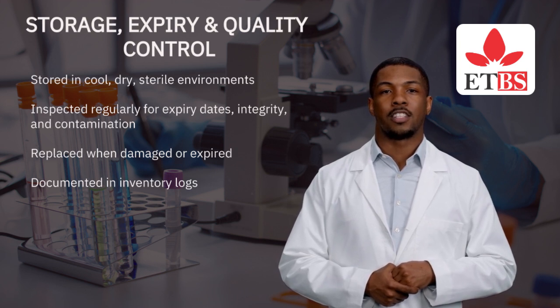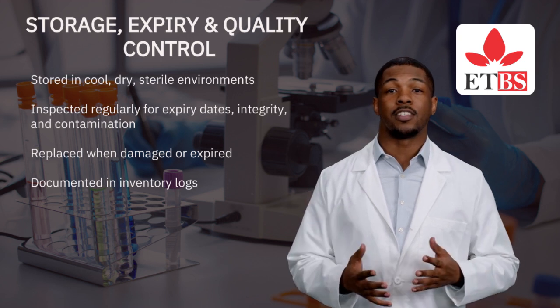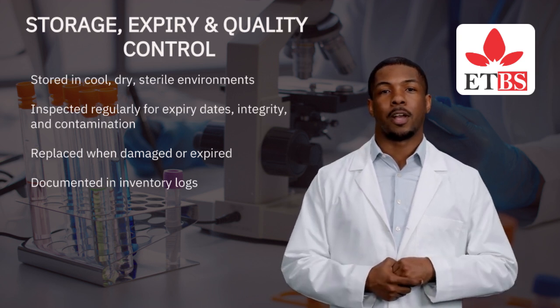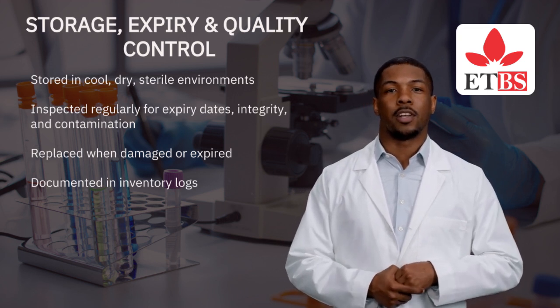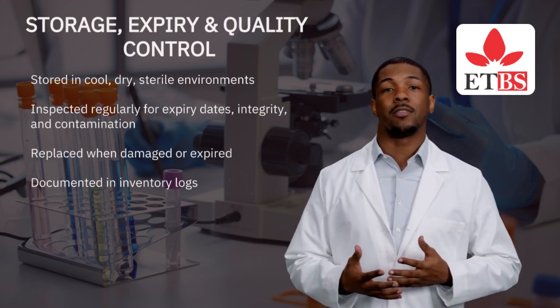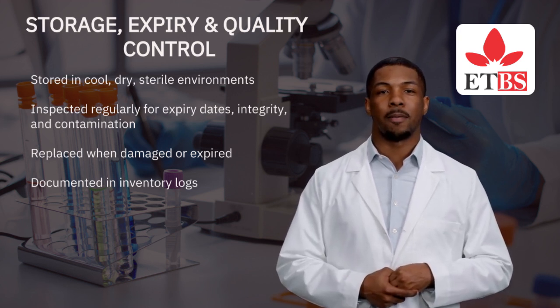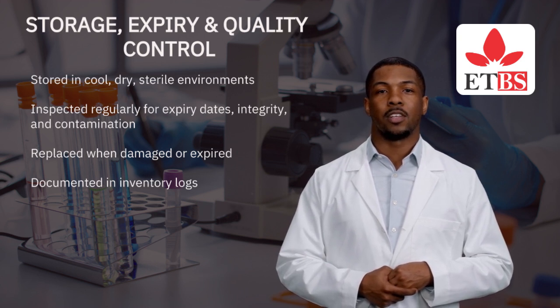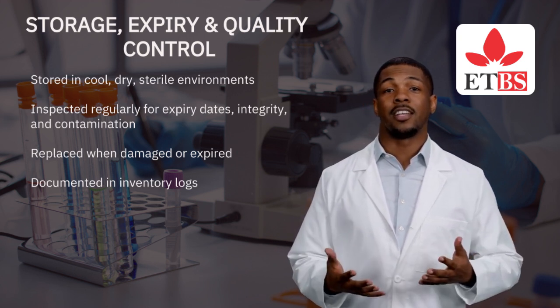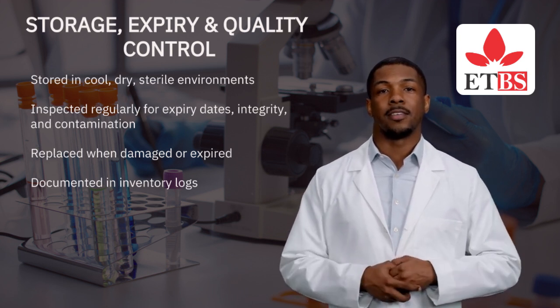4.5 Storage, expiry, and quality control. All phlebotomy supplies must be stored in cool, dry, sterile environments, inspected regularly for expiry dates, integrity, and contamination, replaced when damaged or expired, and documented in inventory logs. Accreditation compliance requires that clinical labs use CE, FDA-approved collection materials, conduct periodic validation and calibration, and implement inventory tracking systems.